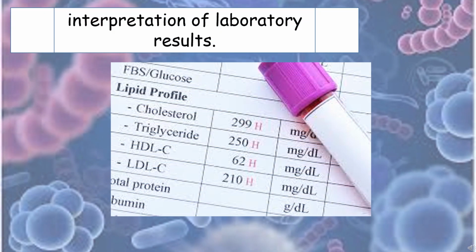Above all, the clinical microbiology laboratory, whenever appropriate, should provide an interpretation of laboratory results. Interpreting laboratory results involves comparing a patient's test values to a normal reference range provided by the lab, where a result falling within that range is considered normal, while values outside the range may indicate a potential medical condition requiring further evaluation. This analysis takes into account factors like the specific test performed, patient history, and other clinical findings to reach a diagnosis.